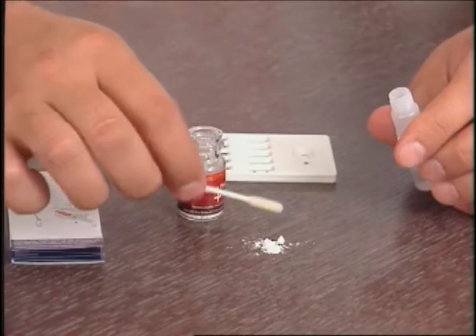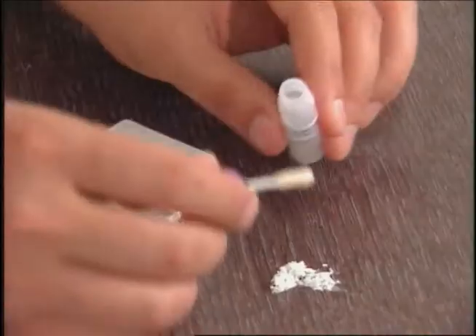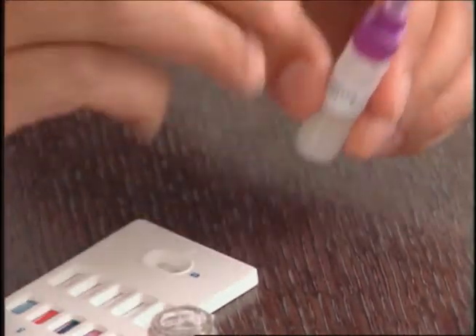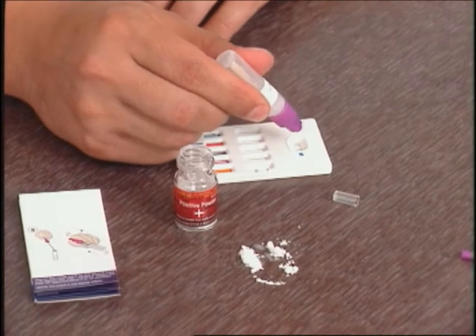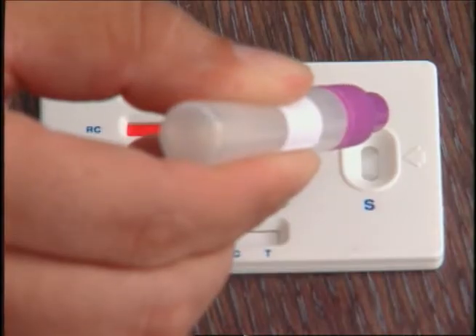The suspicious material is swabbed. The material is thoroughly shaken. Once mixed, the top can easily be popped off. Ten drops are enough to activate the test strips.